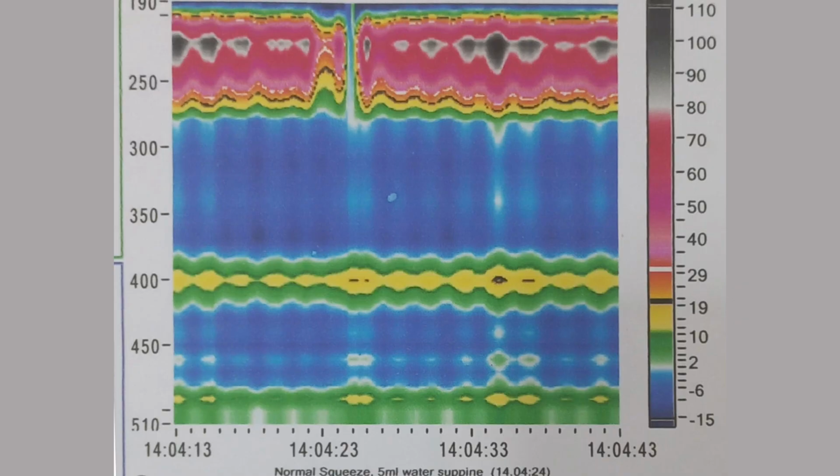This is manometry image of this patient. You can appreciate there is absolutely no peristalsis in the esophageal body, and there is no relaxation of the lower esophageal sphincter during the swallow.